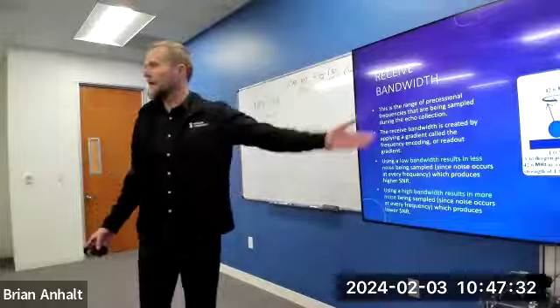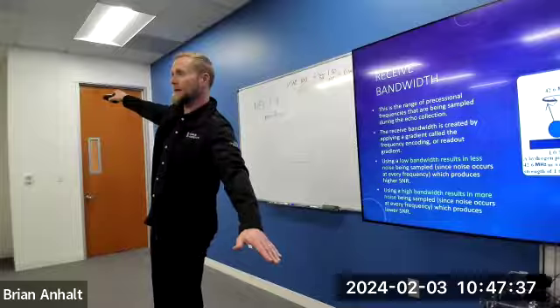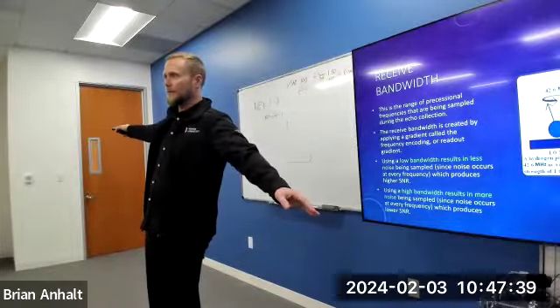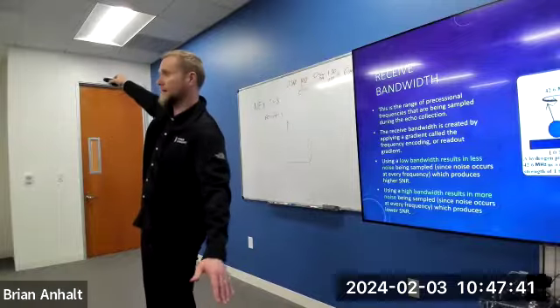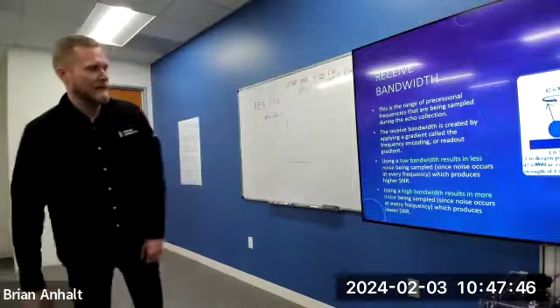But we determine that, right? You're the operator. You can pick it. 125 kilohertz bandwidth, it's making the gradient do this to create a range of frequencies. Put on a 200 kilohertz bandwidth, that gradient is going to be steeper, right? We're passing more current through the coils to get that higher bandwidth.